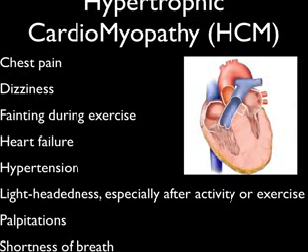It's very difficult to do on physical exam, if not impossible. You can see some of the symptoms listed there, but essentially what happens is the physical exam can only pick up about 3% of the patients before they experience sudden cardiac death. One study found that the incidence of sudden cardiovascular death in young competitive athletes declined in the Veneto region in Italy by 89% once they introduced routine hypertrophic cardiomyopathy screening of athletes. And a bedside echocardiogram can detect hypertrophic cardiomyopathy with 80% accuracy.